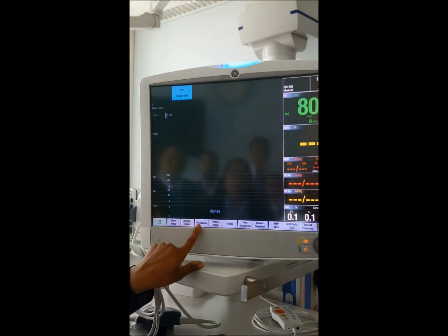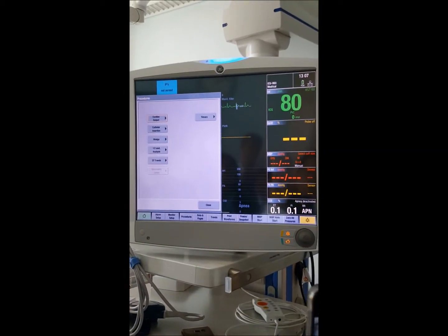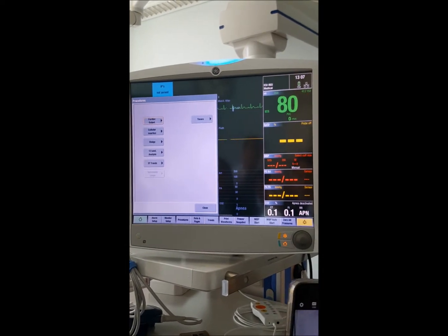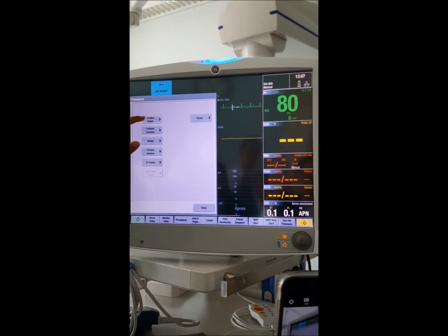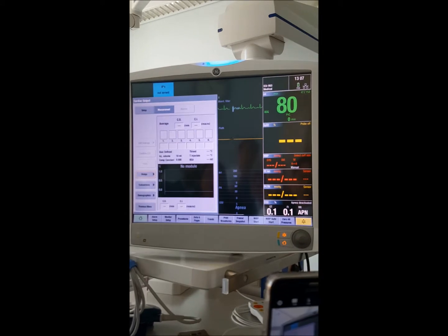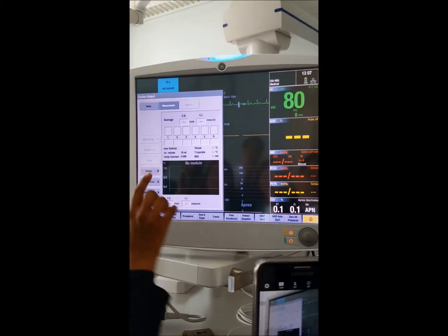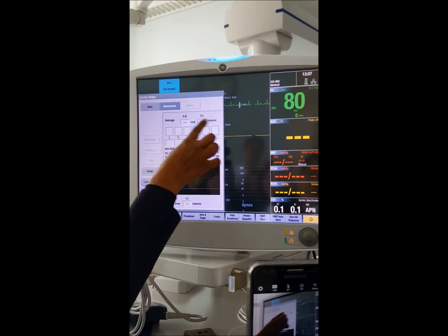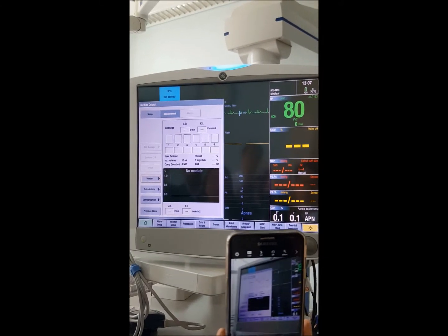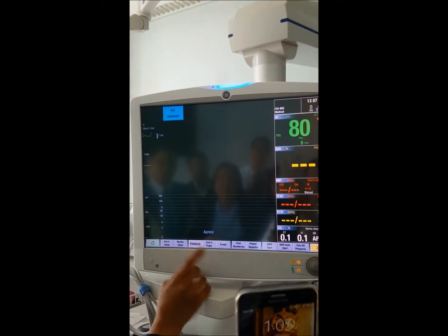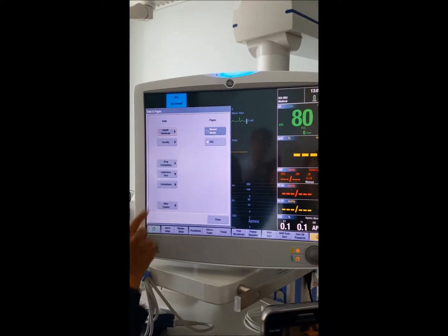For cardiac output, we use the Swan-Ganz catheter method — the same cable and method. When you inject through the catheter, just press and you get your waveform and readings automatically on the screen. That is the cardiac output feature, which is commonly used in the ICU.